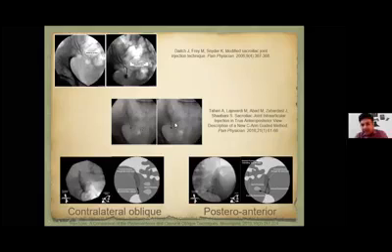This is the AP or PA technique, in which we need not go for any obliquity or cephalad position of the fluoroscope. We can do it directly. It is very fast. The important thing is that you will see two joint lines here, the medial joint line and the lateral joint line. Always remember, this is the golden point: the medial joint line is where you need to go. This is the posterior one, while the lateral joint line is the anterior sacroiliac joint. So go for the medial joint line in the inferior part, just like you normally do. A little cephalad position of the needle is advisable. Try to go a little towards the S2 foramen.